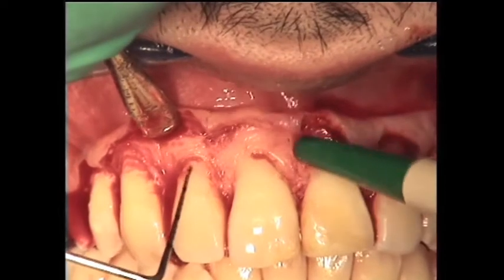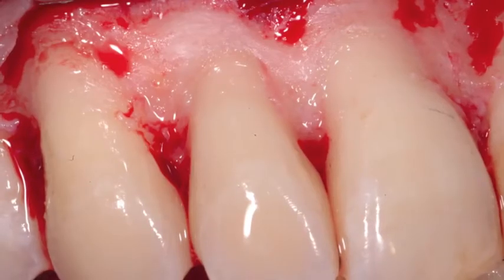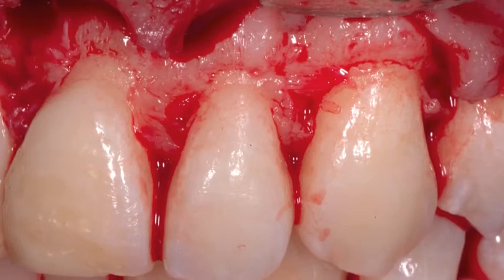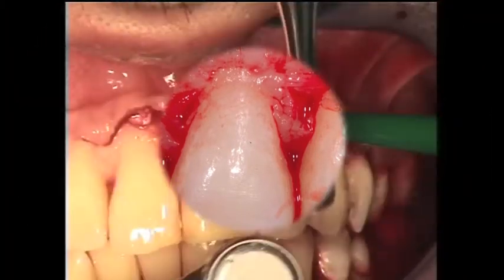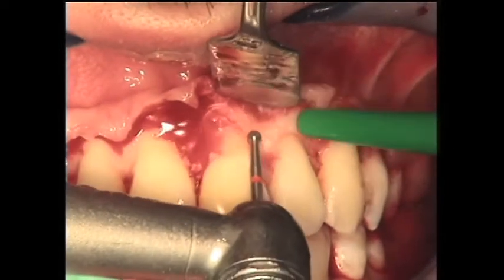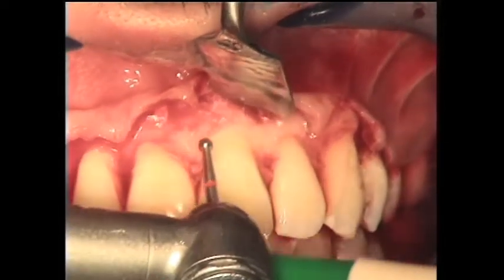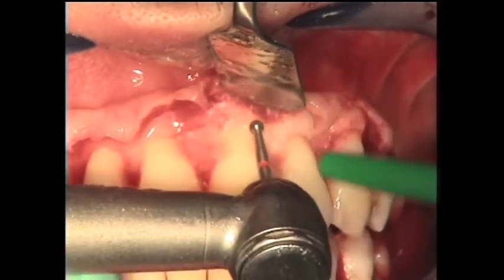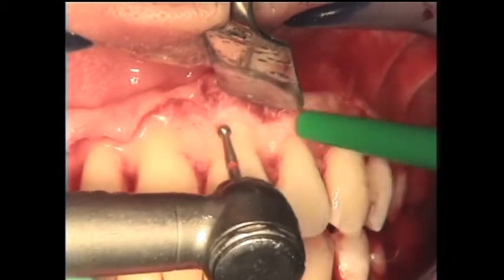Now we can go back with the periodontal probe and measure the biologic width that we have achieved. The same thing is done in the second quadrant. The burr is applied to the bone without using any kind of pressure.